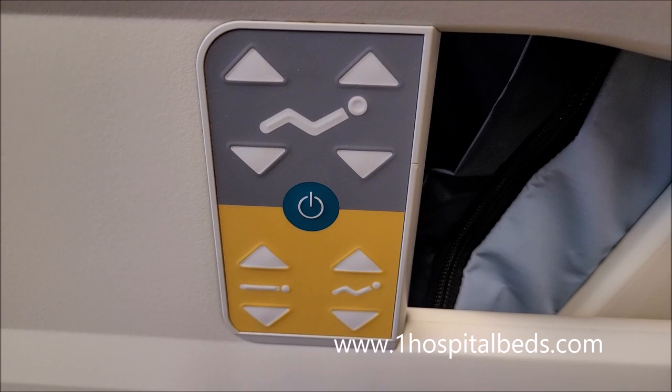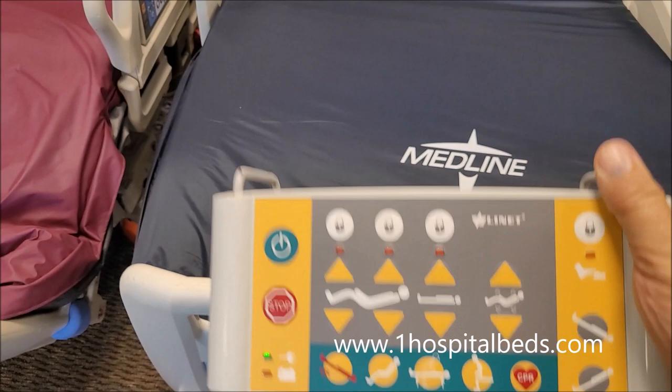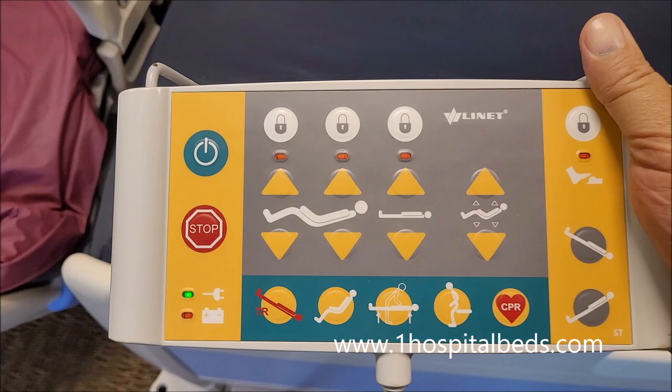You've got your controls on the outside rail for the nurse or the caregiver. You have controls on the inside rail on both sides here for the patient. But what's really nice about this bed is you have a portable station right here where you can control all the different features of the bed. The bed also does have a battery backup, so there are times where you might want to use that.